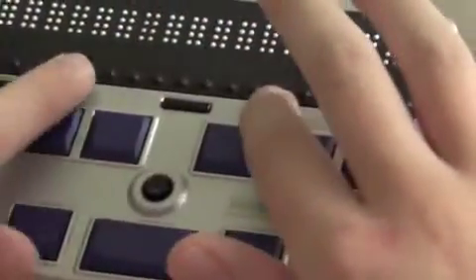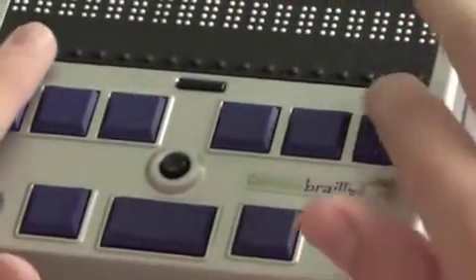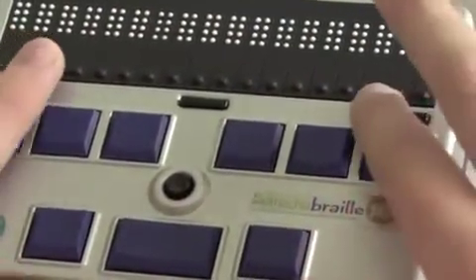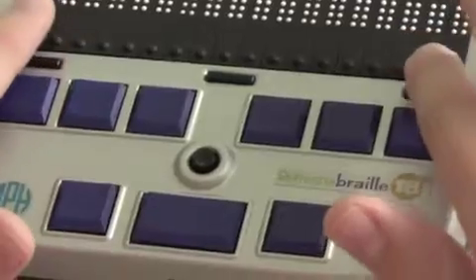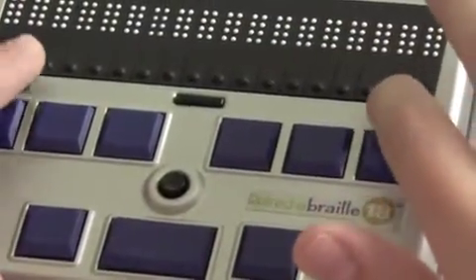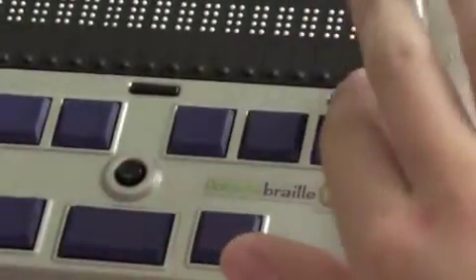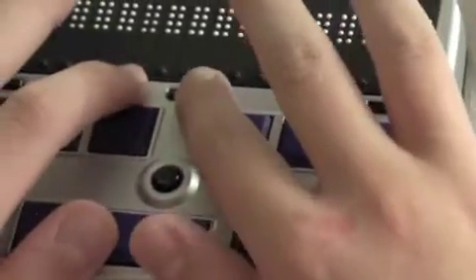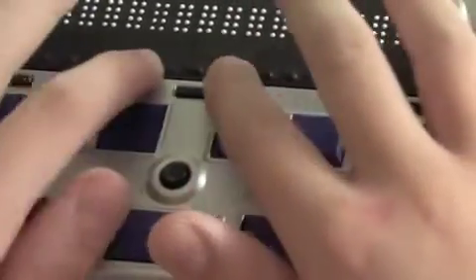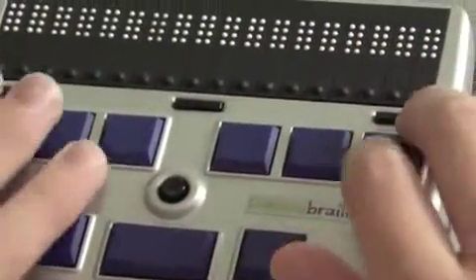Below the cursor routing keys you'll see three buttons spaced a few inches apart: one on the left, one in the middle, and one on the right. The ones on the left and the right are the advance bars, which you'll be familiar with if you use other Braille displays. These are especially useful on the Refresher Braille 18 because since it only has 18 cells, you will need to pan to see a full line. If you are seeing 18 characters and want to move to the next part of the line, just push the right button. The middle button is the auxiliary space button, similar to the advance bars.